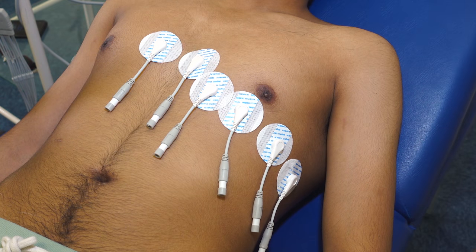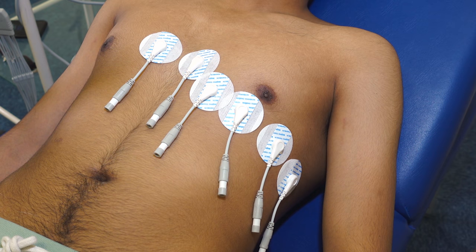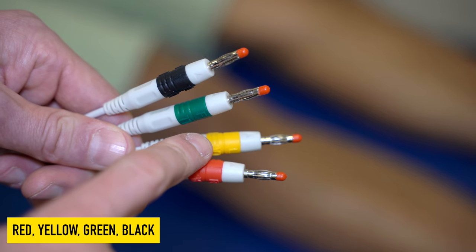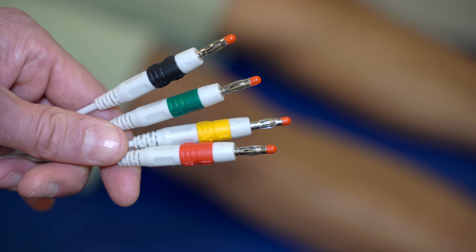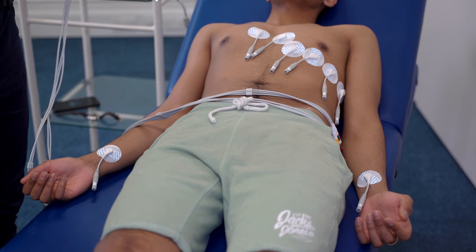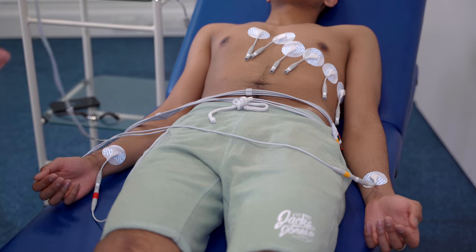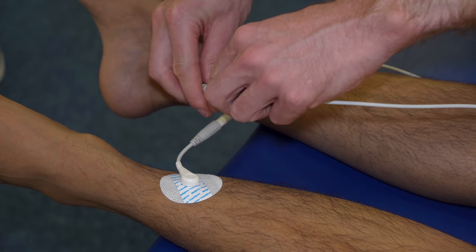This allows us to attach our wiring to the precordial electrodes to get a horizontal or transverse view of the heart. With our electrodes in place, we attach the leads — thankfully these are colour coded for the limb leads. We put red to the right arm, yellow to the left arm, green to the left leg, and black to the right leg, using the mnemonic 'Ride Your Green Bike'. These are applied in a clockwise fashion — red first, then yellow, then green on the left leg, and black to the right leg.